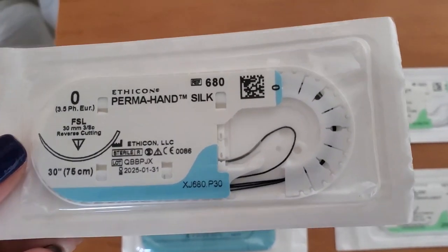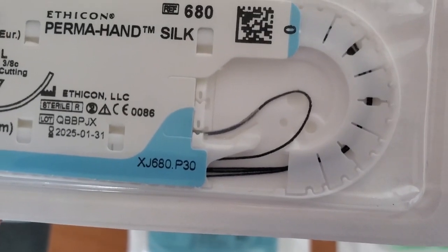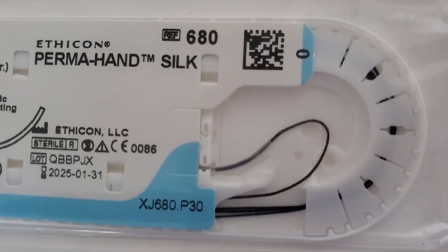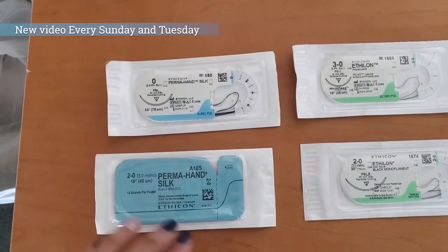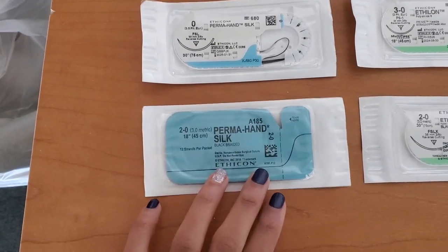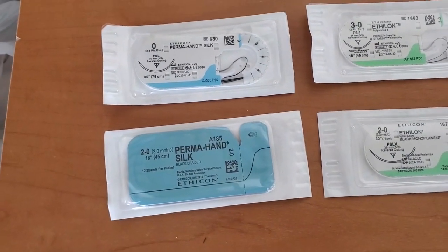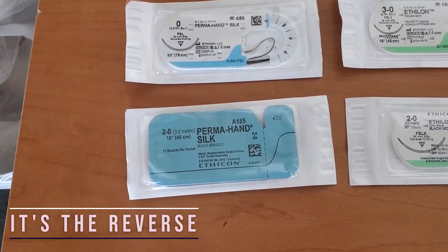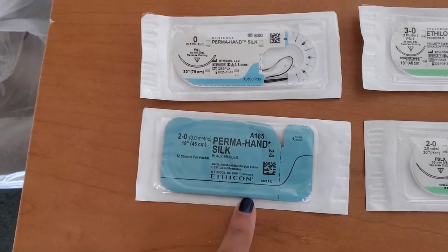It's braided, and you can see, I don't know if we can zoom in a little bit on the filament for you, that it has many different microfilaments in there, but it's a braided suture, okay? And then this is a 2-0, same brand, but 2-0, meaning that when it comes to sutures, you would think, oh, the larger the number, the larger the suture, or the larger the needle, but that is not the case. When it comes to sutures, the smaller the number, the larger the needle and the larger the suture.